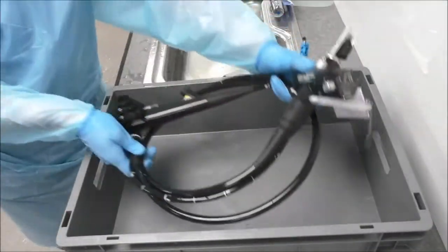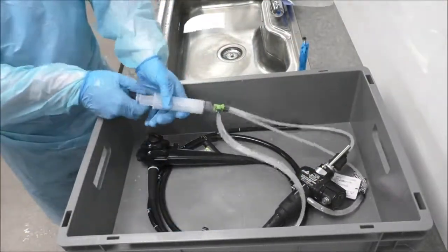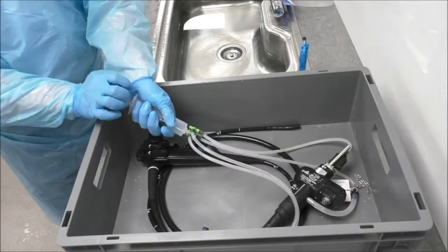Transfer the scope into the reprocessing tray and then aspirate the channels with air 3 times.